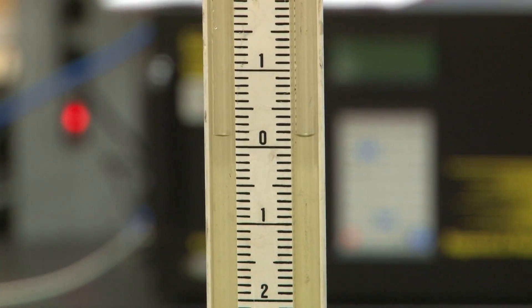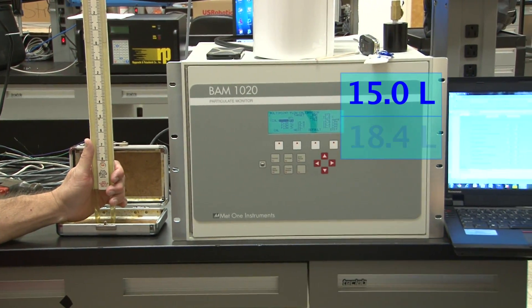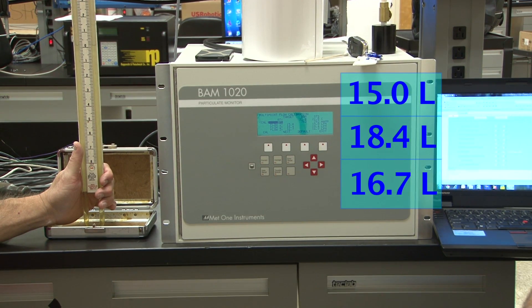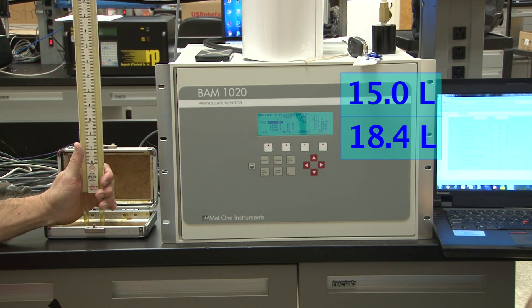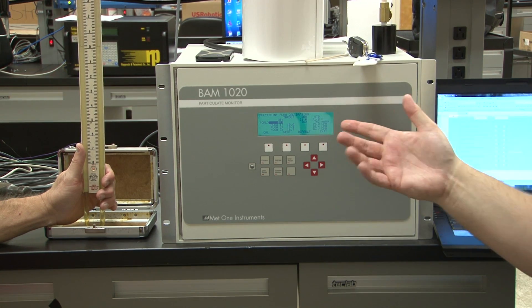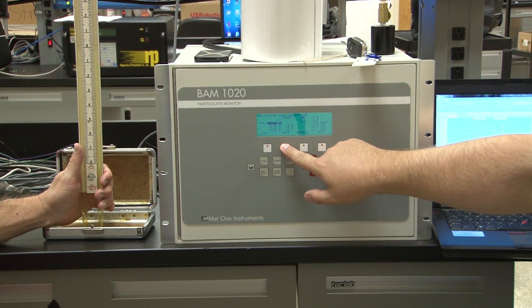We're going to do three separate flow calibrations: at 15 liters, 18.4 liters, and 16.7 liters. 16.7 is your precision point, 18.4 is the high span, and 15.0 is the low span — each 1.7 off from the original goal of 16.7. So you hit Next.